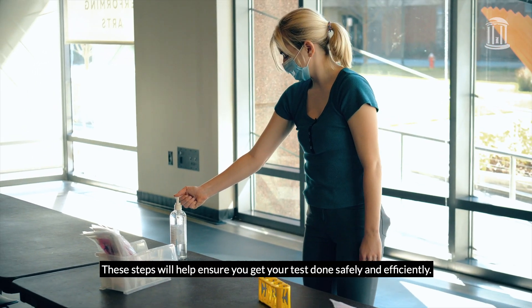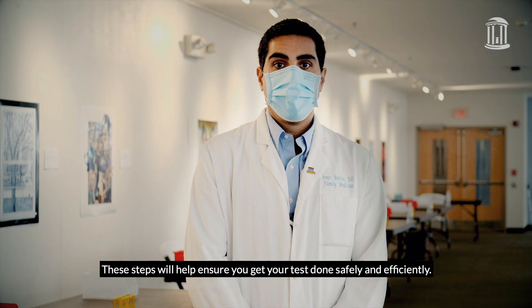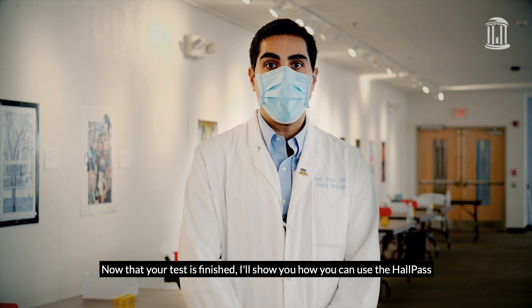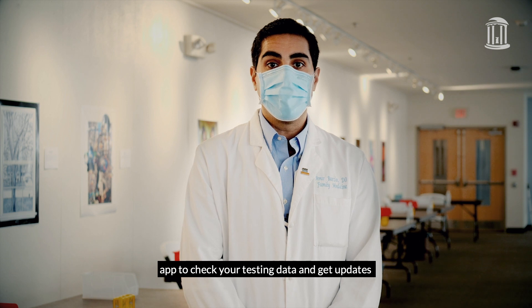These steps will help ensure you get your test done safely and efficiently. Now that your test is finished, I'll show you how you can use the HallPass app to check your testing data and get updates on continuing to be compliant with guidelines.